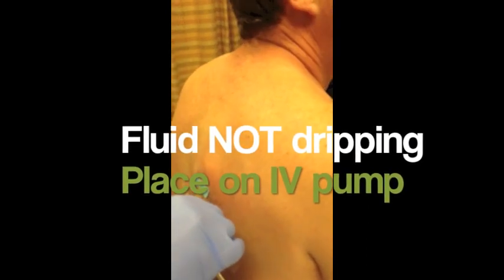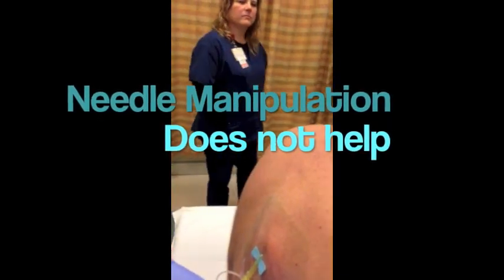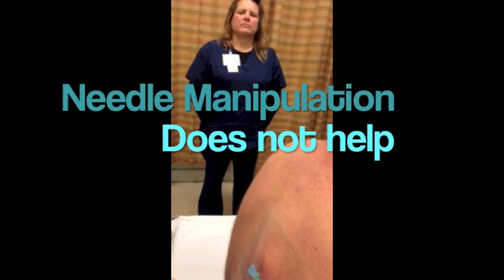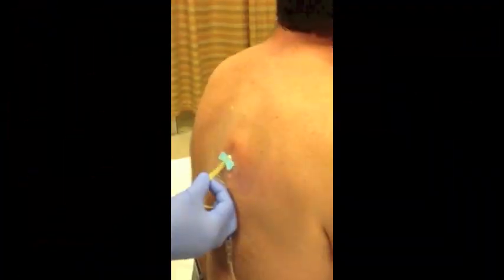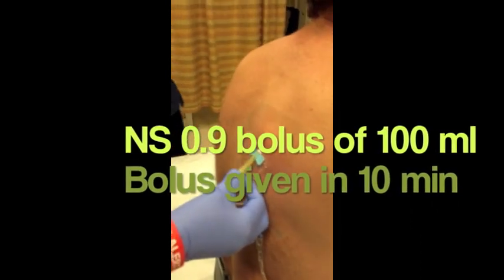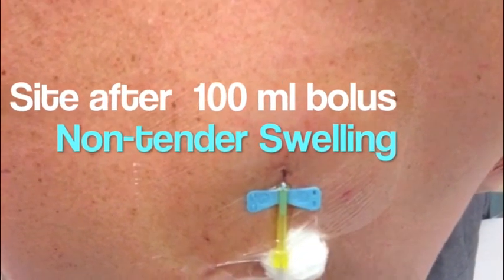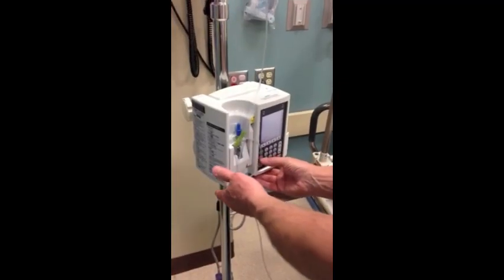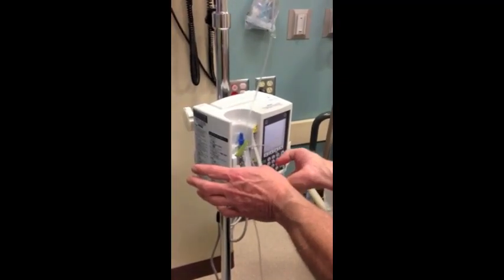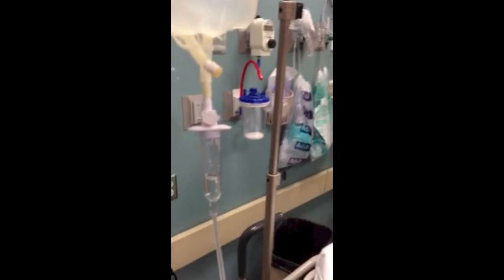We're done. We're going to run some fluid. It's not going. Is this open? Let's try it on a pump. Maybe put the yellow thing up — you know how lab does it? It seems like it was going when you had it up. As it starts to break down, maybe it'll go ahead and start flowing. It's really not swollen. It doesn't hurt. Just put it on gravity.